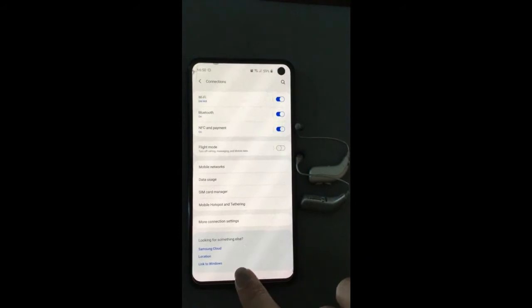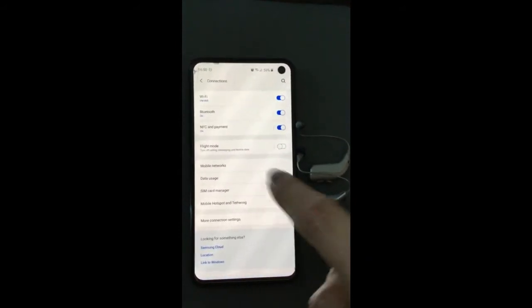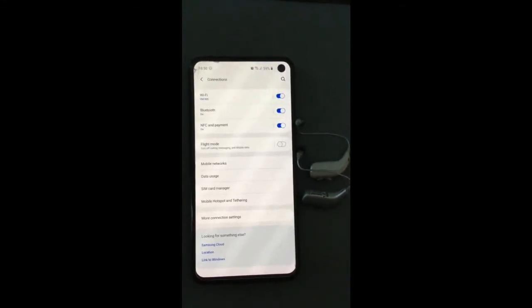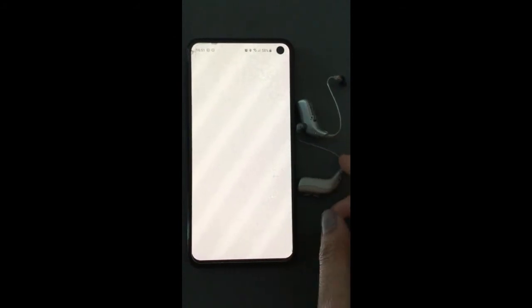Then we want to make sure we've installed the Burnathon EasyControl A app. Once we've installed the app, we're going to open up the Burnathon Viron app.